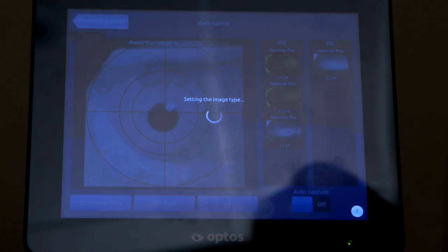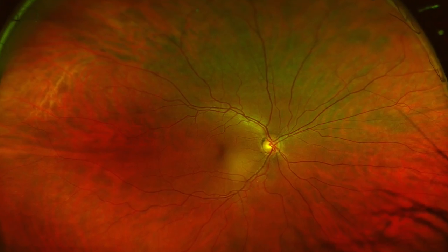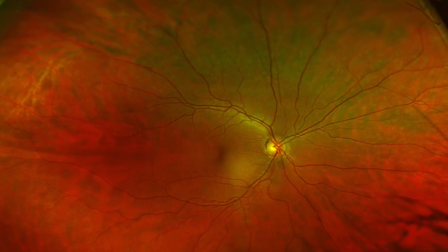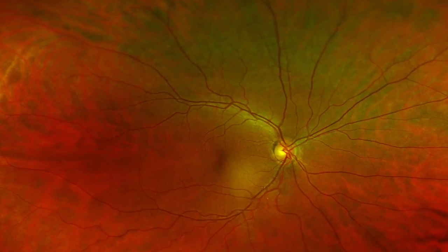With the Optos, we can see very far out into the peripheral retina with this instrument. As well, we can actually see layers of the retina we can't otherwise see, even in the central part of the retina. We will detect things like glaucoma more readily with this.